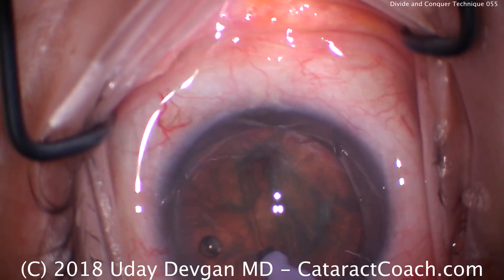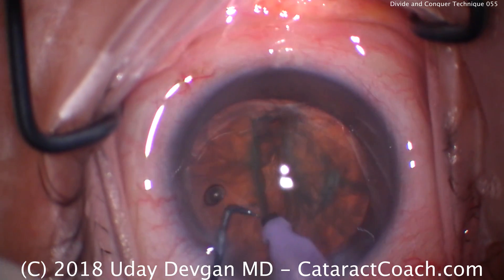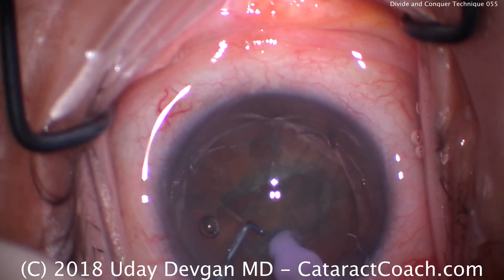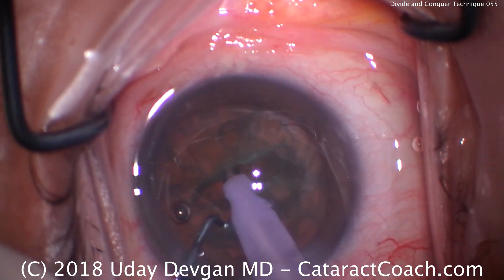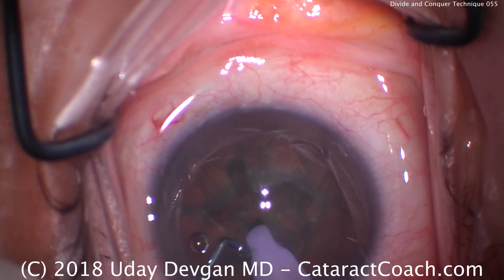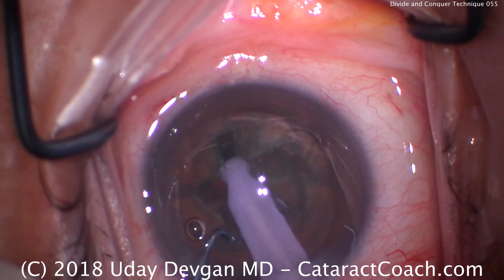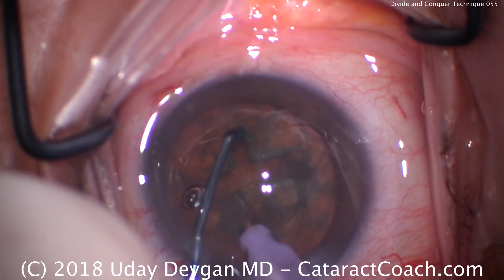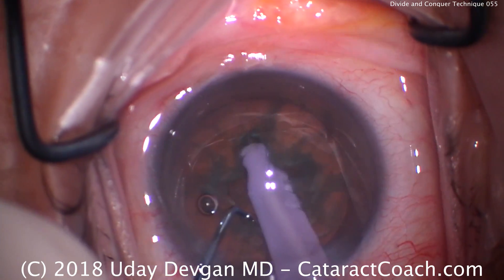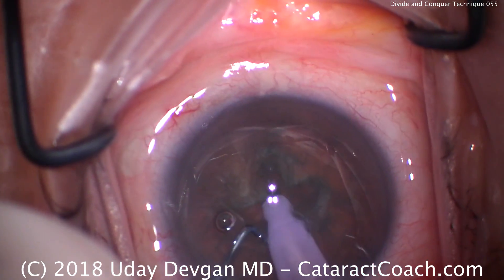Now go into the deepest part of that central groove — that's enough. Now we're going to rotate the nucleus about 90 degrees and continue with another groove. This also debulks the center. It's important that you make these grooves clean with nice edges and nice walls. We'll put instruments in that groove, rotate another 90 degrees, continue this original groove, rotate another 90 degrees — and now we've got all our grooves sculpted.